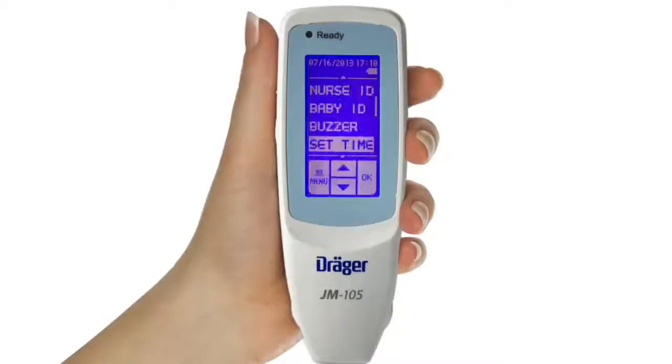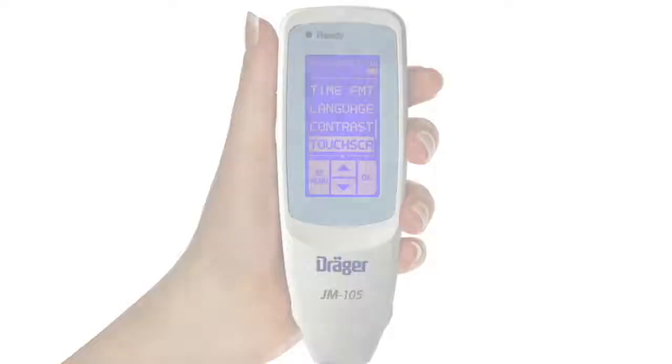The JM105 has several other useful features. From the configuration menu, users can set the current date and time, choose a date and time format, select a display language other than English, adjust the contrast level of the display, and adjust the sensitivity of the touchscreen.